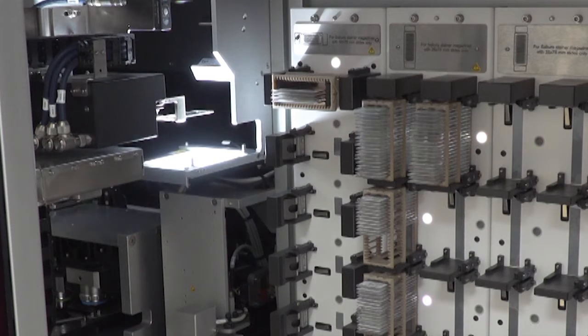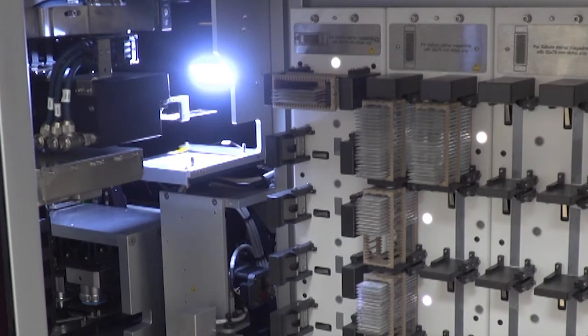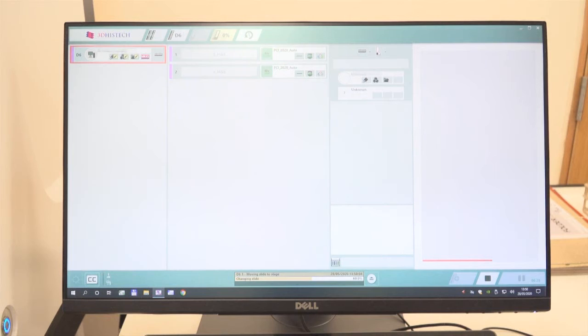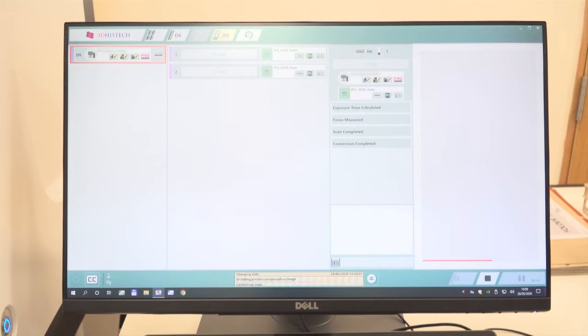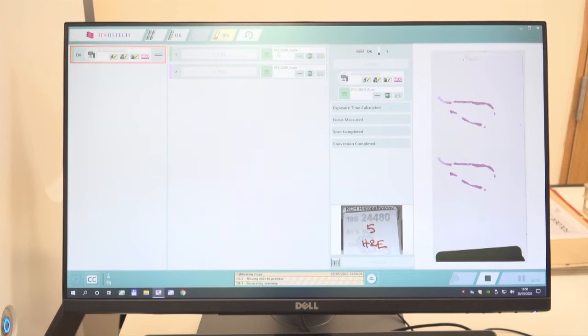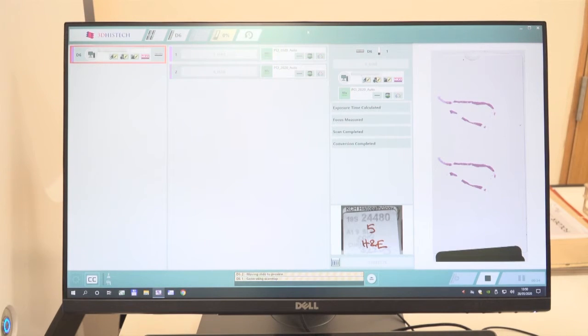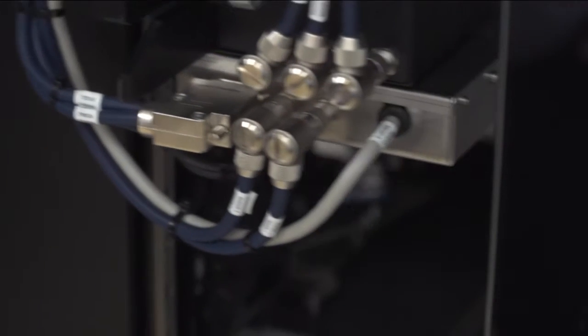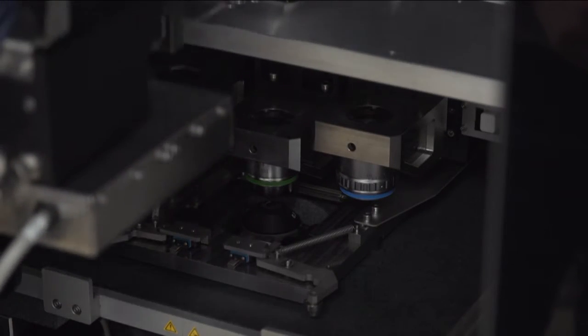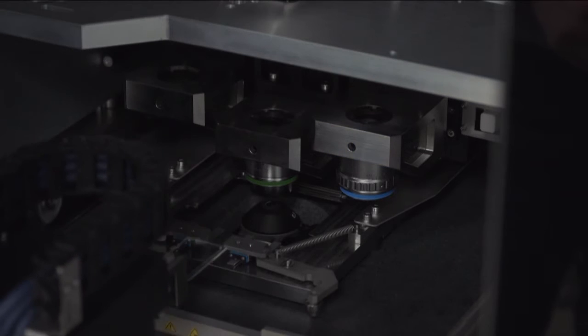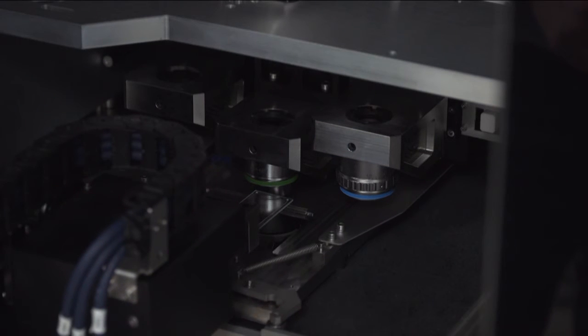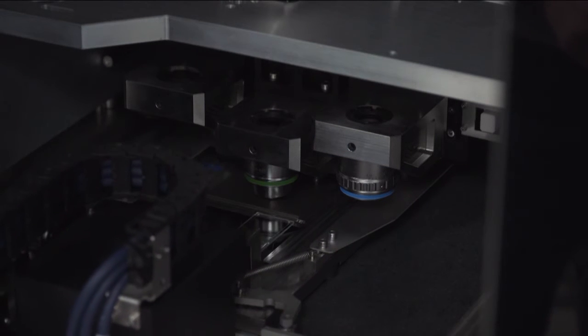The preview is in two parts. The first is Specimen, and the second is Label Area. The system will recognize the tissue, apply the default scan profile, show you in red the areas that will be scanned, and at the same time the slide is taken to the stage, which can hold two normal slides or one mega slide.